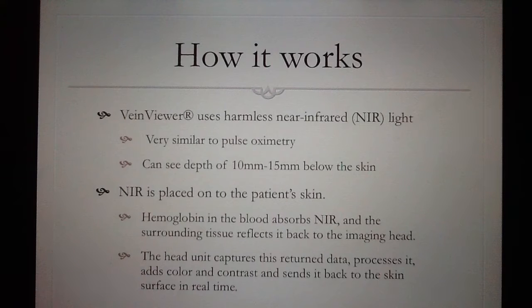The way it works is it uses NIR, or near-infrared light. It's very similar to the pulse oximetry that we use on the floor to gain patients' pulse oxygen levels. It can see a depth up to 10 to 15 millimeters below the skin. The near-infrared light is projected onto the skin, and the hemoglobin absorbs this light, sending the information back to the computer in the machine, and then sending a live feedback directly back onto the skin, so it's live data.